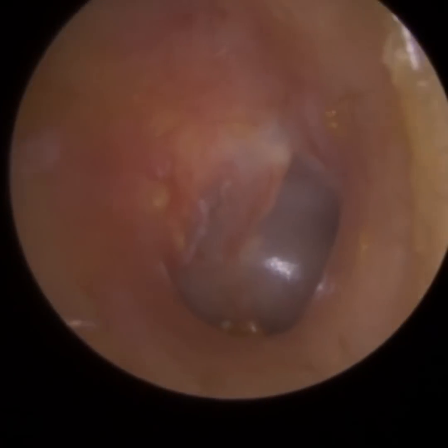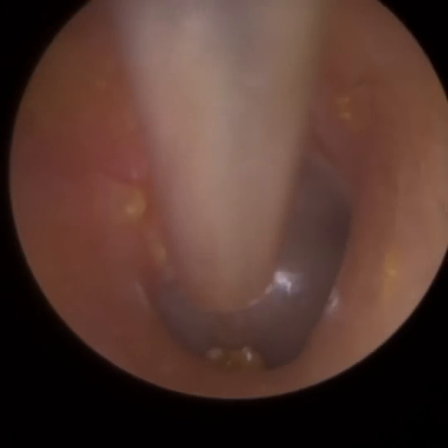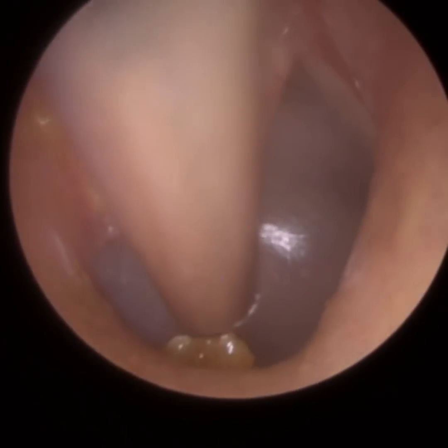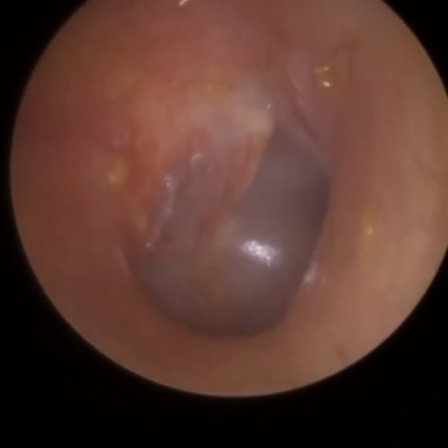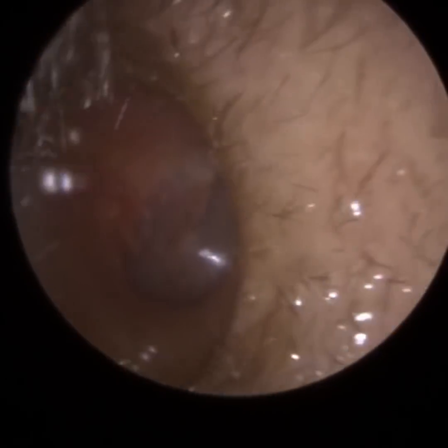So the right ear came out a lot easier. This is the patient's worse ear. It was more impacted. You can see the eardrum and the medial part of the ear canal is slightly more red. A bit of soft wax there. If it's a Clear Wax delegate, I would advise them to just leave that. But because I've been doing this for a long time now, I decided to just remove that, and there's a still image.